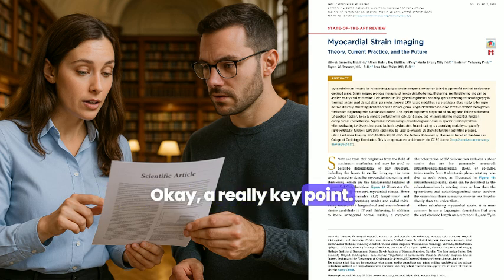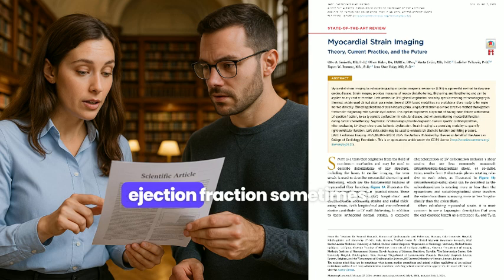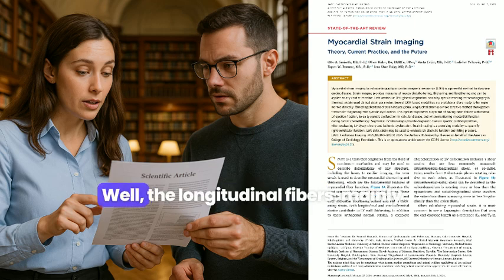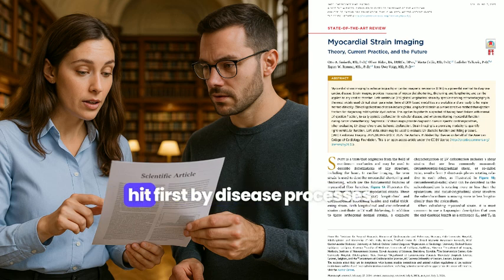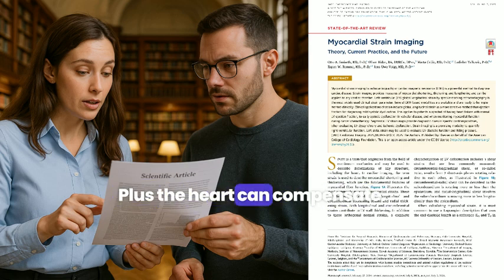Okay, a really key point. Why is strain better, or at least more sensitive, than ejection fraction sometimes? Great question. GLS often picks up problems earlier than LVEF. Why? Well, the longitudinal fibers, mainly in the subendocardium, are often hit first by disease processes. So GLS drops before EF. Often, yes. EF is more influenced by the mid-wall circumferential fibers, plus the heart can compensate.